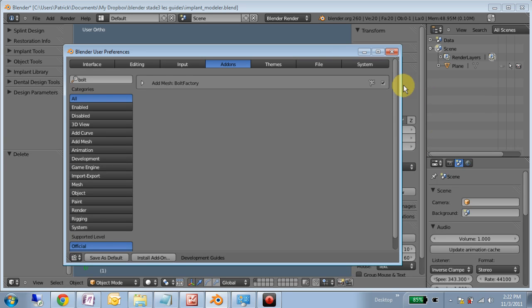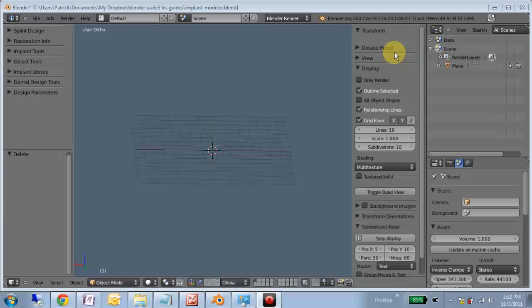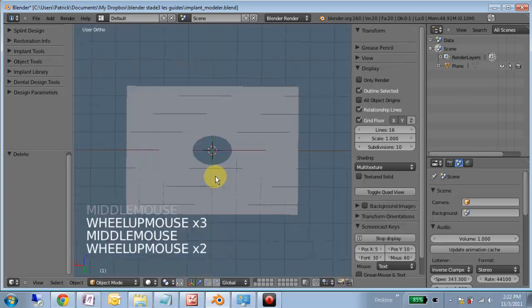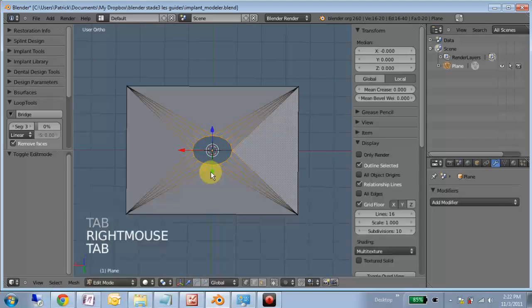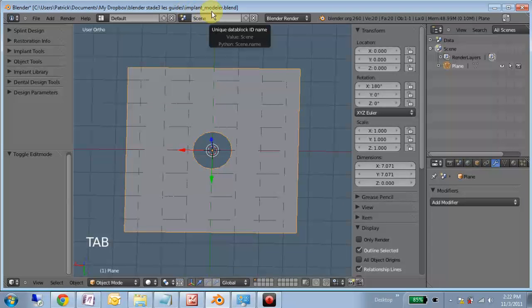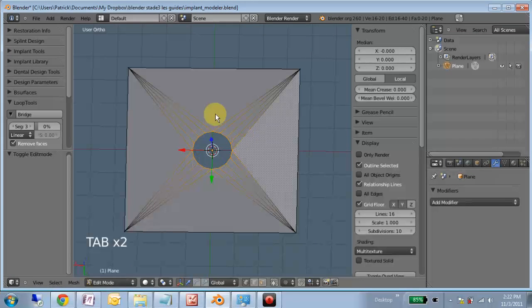This is only the external part of the implant. For the second part of this tutorial, you will need the Bolt Factory add-on enabled. And I also have this plane here, which will come into play later. But for now, I'm just going to save this file as the implant modeler so that you don't have to bother making this plane.